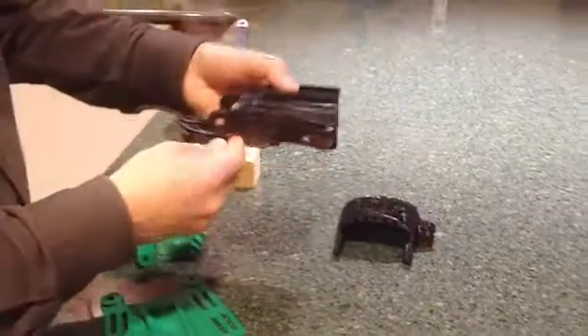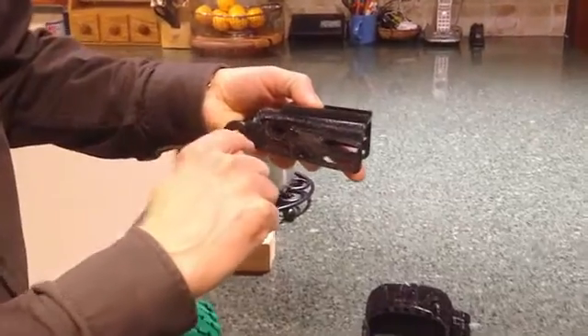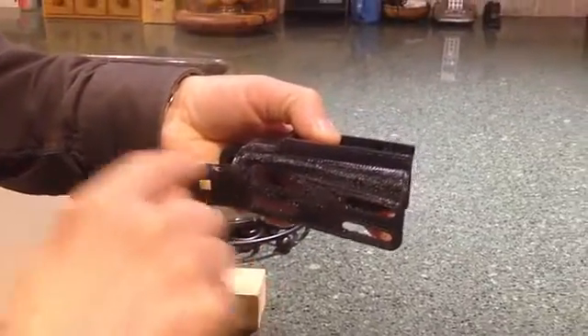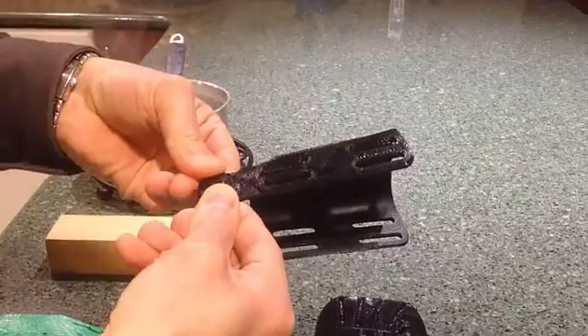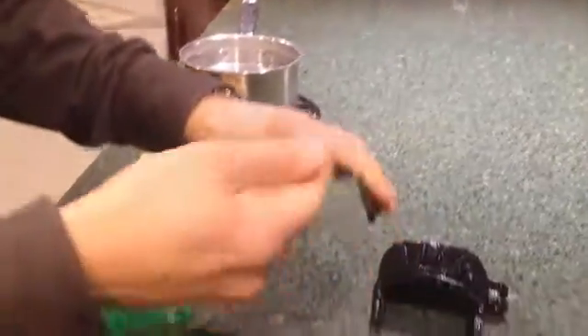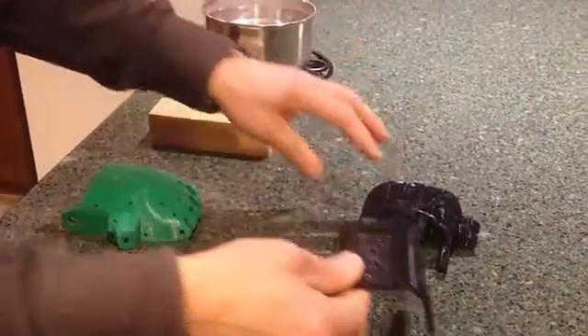When you print a gauntlet using ordinary 3D printing techniques, the layer lines go along and through the hinge, which means that — rather like a piece of wood — it's very easy to snap it. This makes the hinge a weak point. It also ends up as a rather heavy unit with thick walls and a lot of plastic being used.